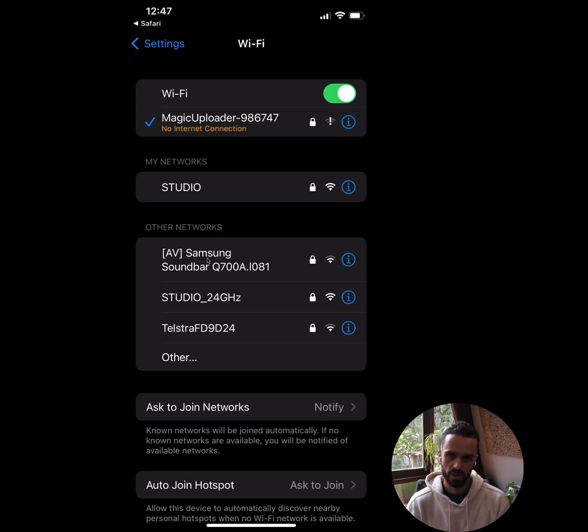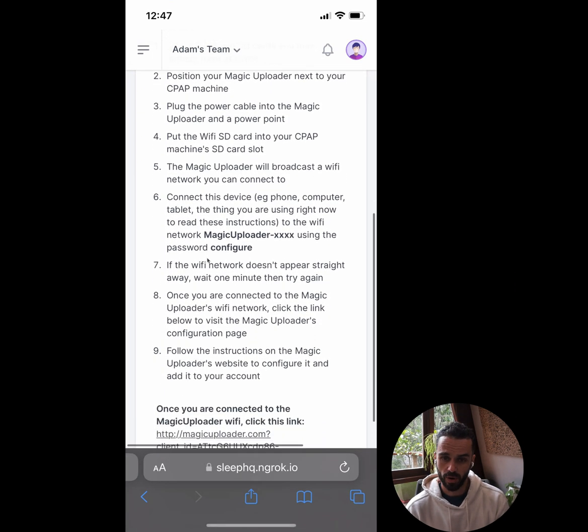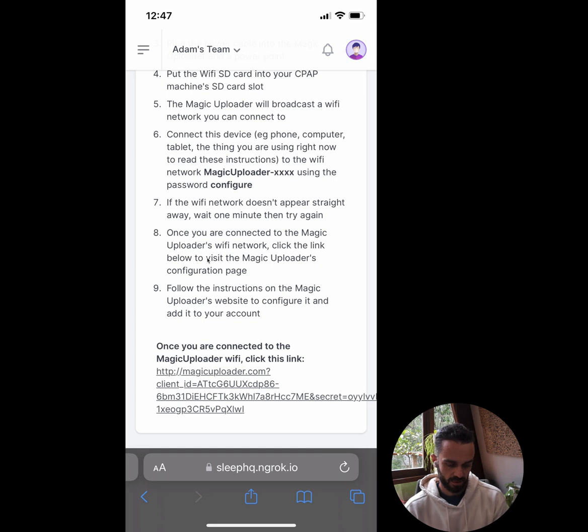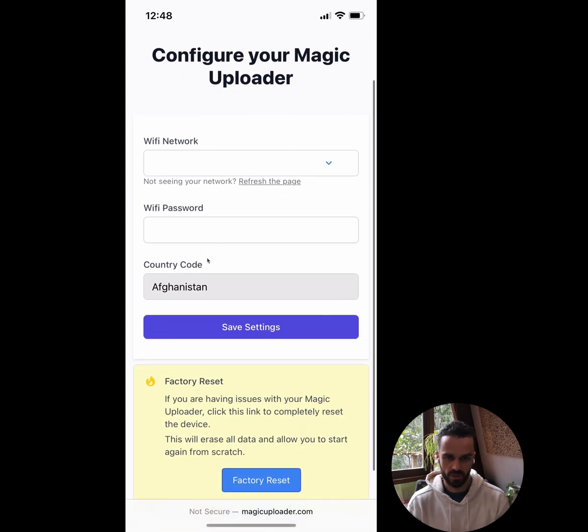Now that I'm connected to the Magic Uploader's WiFi, I need to go back to my browser where I was logged into SleepHQ. I've still got the page up from before. At the very bottom of the screen it says 'once you're connected to the Magic Uploader WiFi, click this link,' so I'm going to click that. It takes me across to the Magic Uploader's configuration screen — I can only access this while I'm connected to the Magic Uploader's WiFi network.